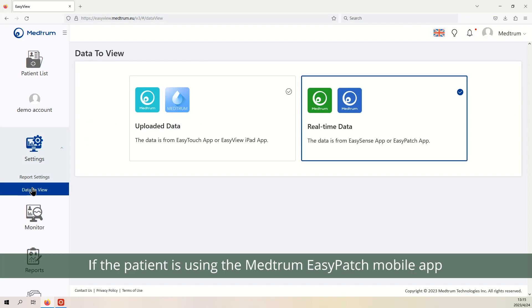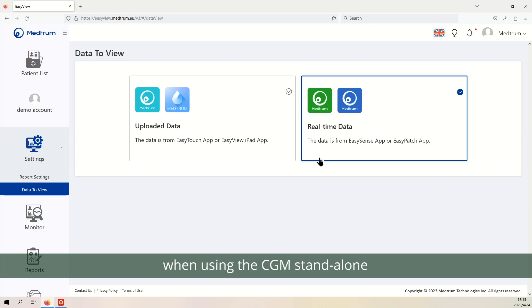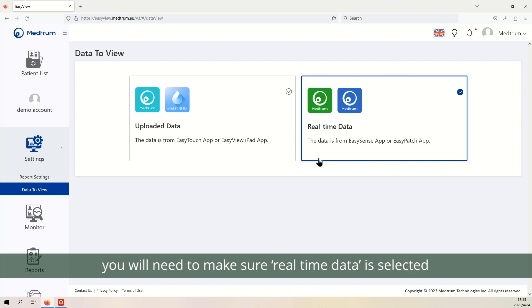If the patient is using the Medrum Easy Patch mobile app to control their pump, or the Medrum Easy Sense app when using the CGM stand-alone, you will need to make sure real-time data is selected.